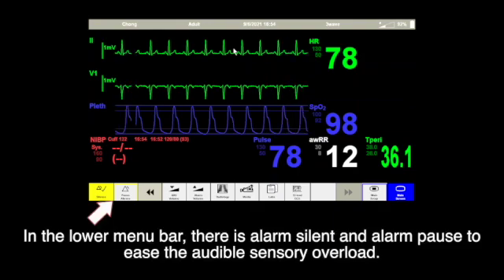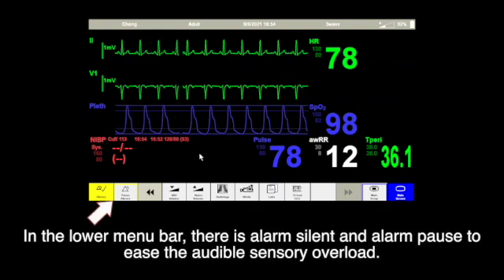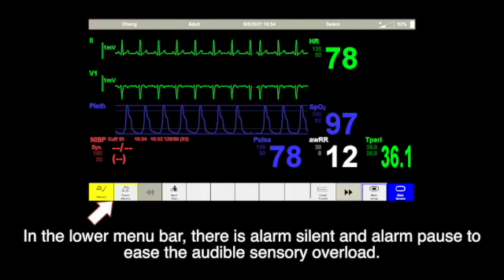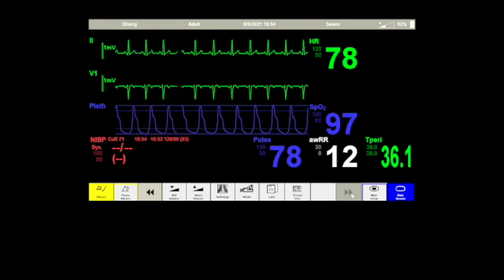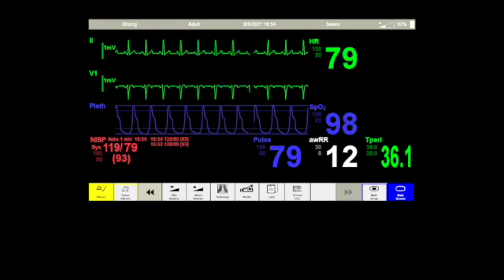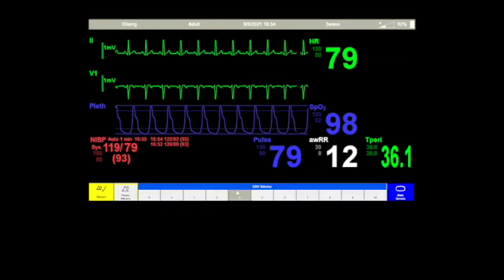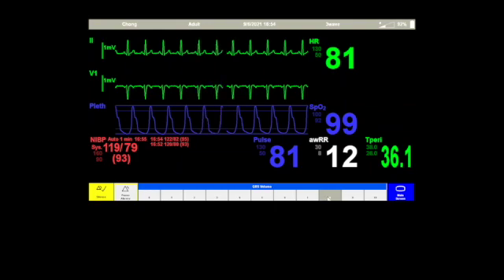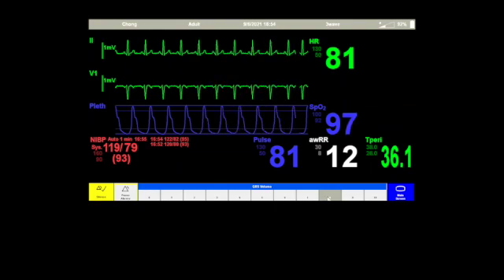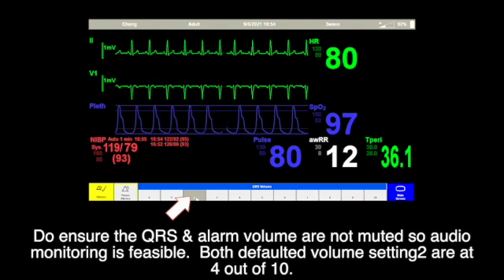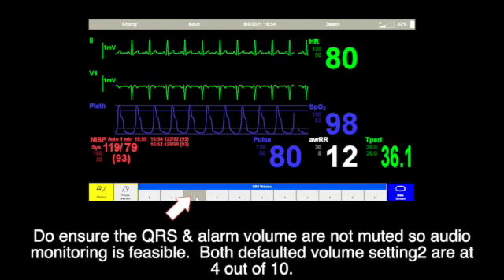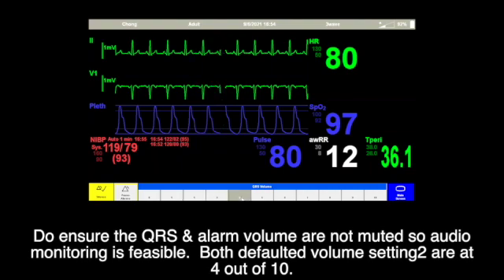In the lower menu bar, there is alarm silence and alarm pause to ease audio sensory overload. To ensure the QRS and alarm volumes are not muted, so audio monitoring is feasible. Both default volume settings are at 4 out of 10.